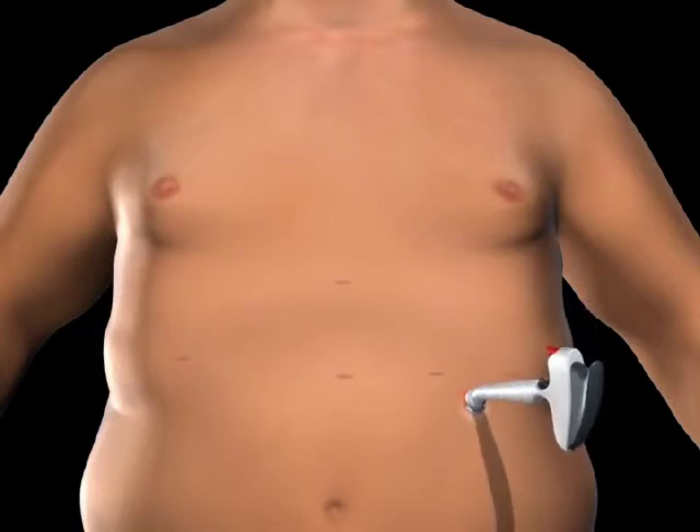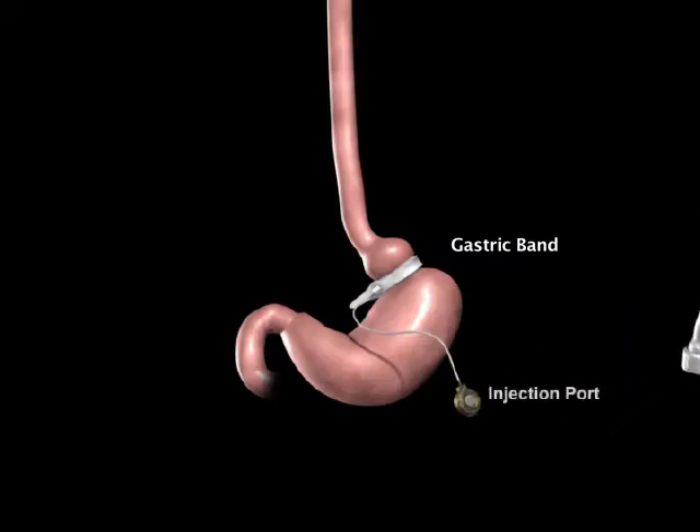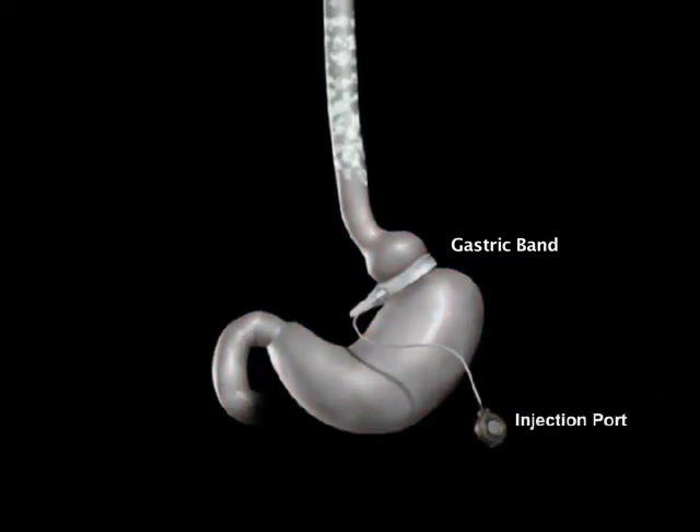The band does not alter your digestive function. Food consumed passes through the digestive tract in a normal route.